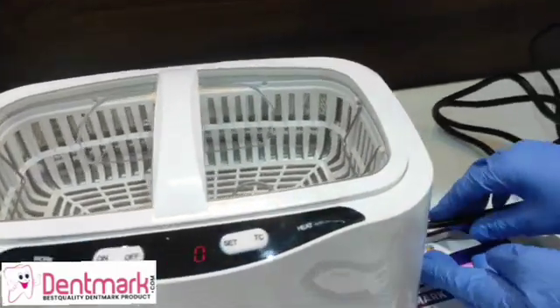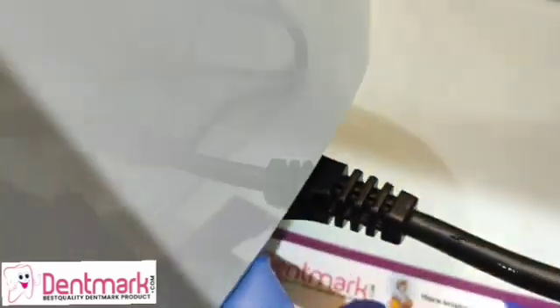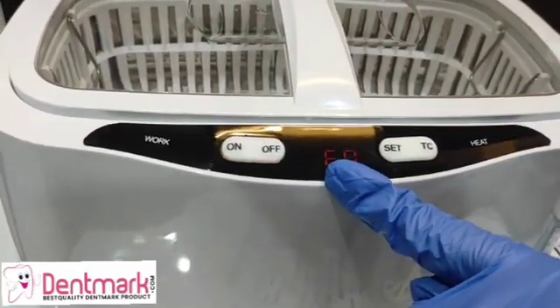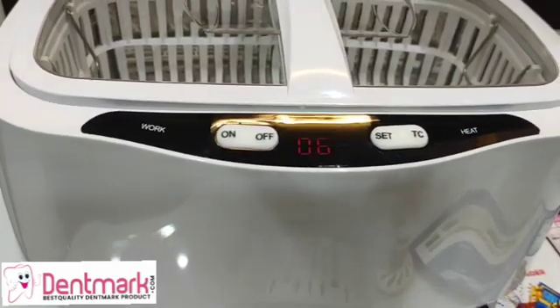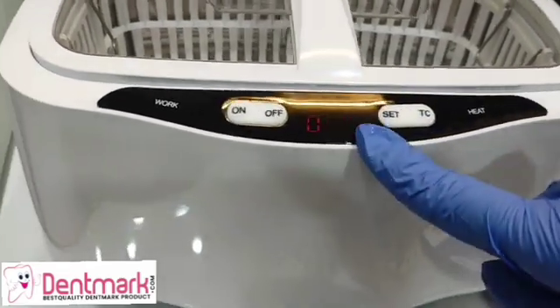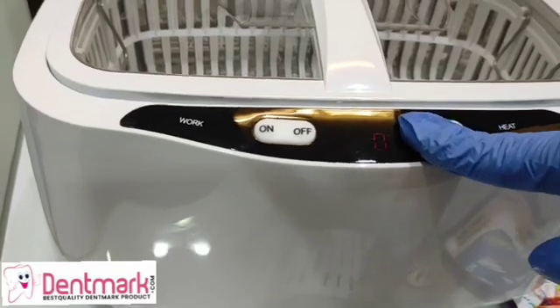Now let's cover it with the lid. First, you need to plug the cord in here with these pins, and insert the cord into your electrical power supply. We will switch this on — it's now ready to function. This is the on/off button, and this is where you set the timer. The timer goes from one minute up to eight minutes, shown in seconds — 60 seconds, 120 seconds, up to 480 seconds.